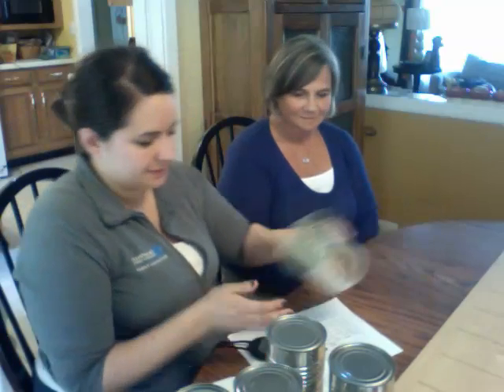Very good. All right, and so again, we would do this with your other hand, but for time purposes, we're going to leave that out.